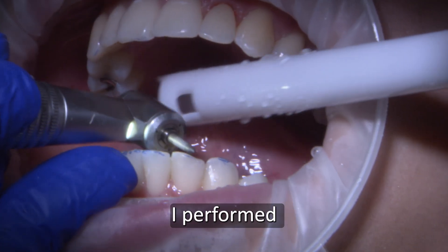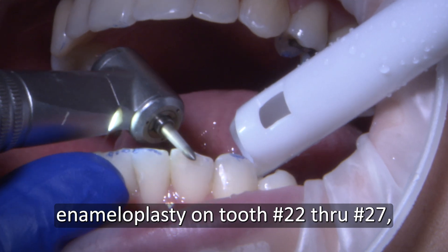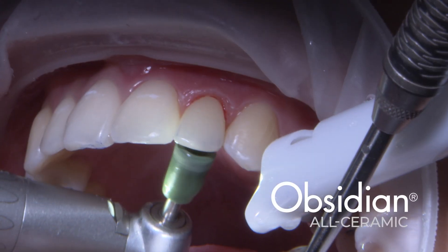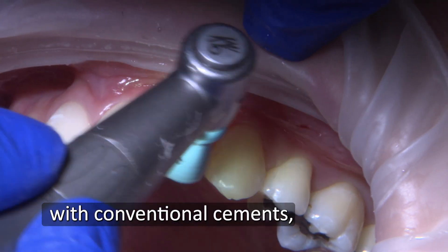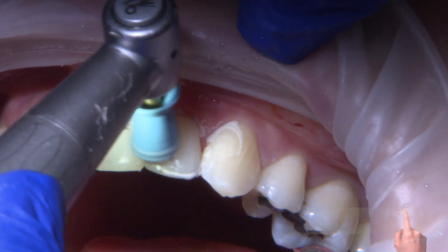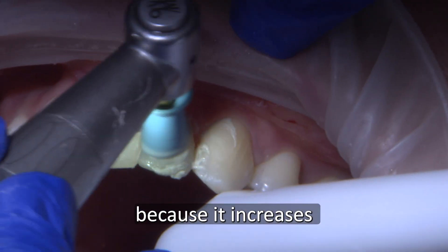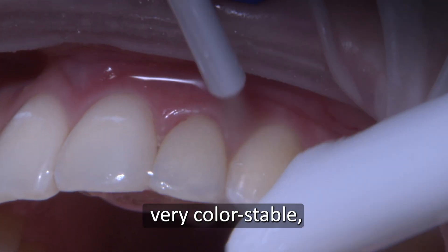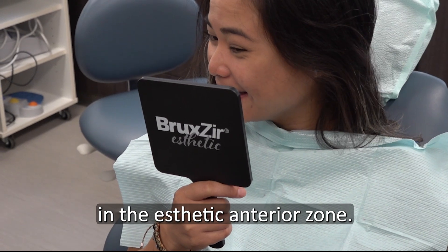On the lower arch, I performed enamelplasty on teeth numbers 22 through 27, contouring the teeth to a natural, more even state. Obsidian glass ceramic restorations can be retained with conventional cements, self-adhesive resin cements, or adhesive resin cements. In this case, I chose bonded cementation because it increases the crown strength. Also, resin cement is very color stable, which makes it especially suitable in the aesthetic anterior zone.